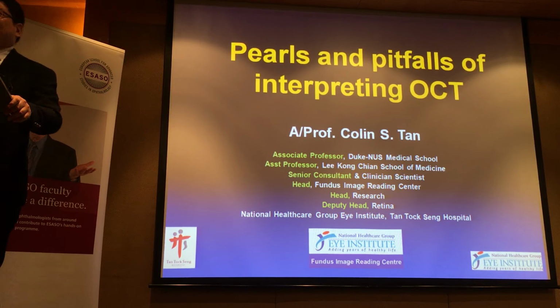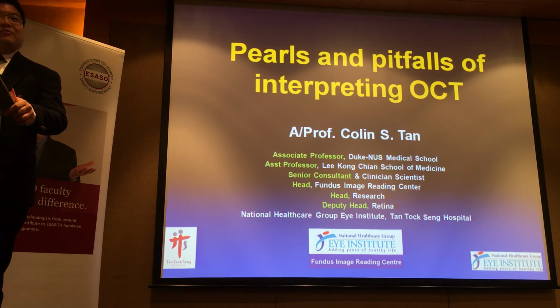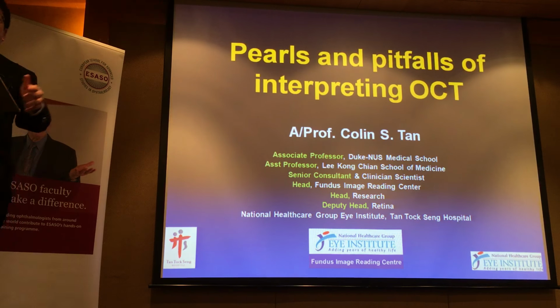Today, in my clinic, if the patient walks in with no OCT, my question is, in a probably more frustrated, curt tone, why has an OCT not been done? So it's a very different thing. In fact, I have a standing instruction to my team to screen all the patients. Anyone with no pupil dilation, this is a retina clinic, right? With no pupil dilation and no OCT, please alert me. I will review. Maybe there's a reason for that, but if not, we're going to do it first. Saves time anyway.